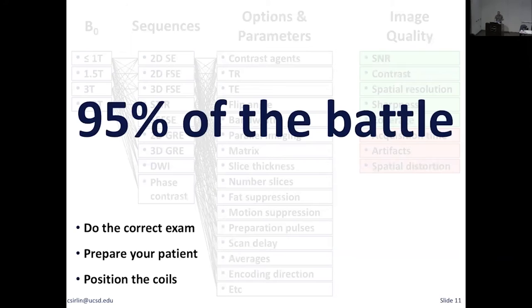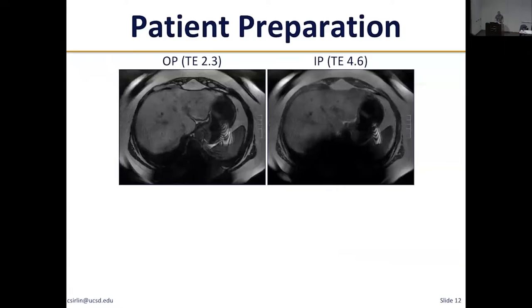So I'm going to spend a few minutes talking about 95% of the battle, and then I'm going to spend the rest of the lecture talking about all this other stuff that's really only 5% of the battle. So let's talk about 95% of the battle. The first is prepare your patient.